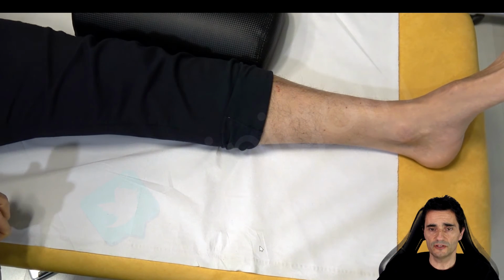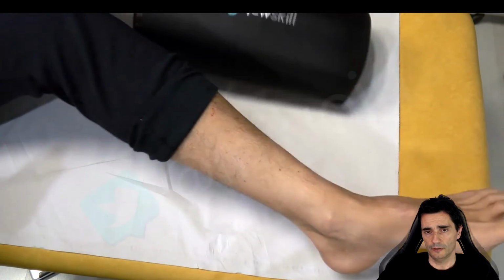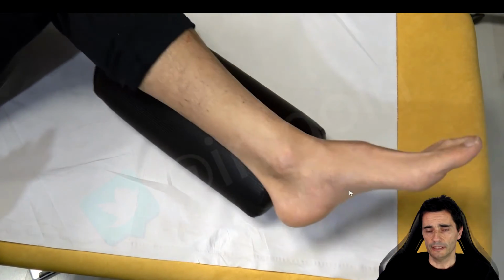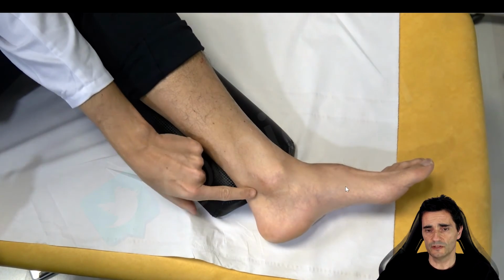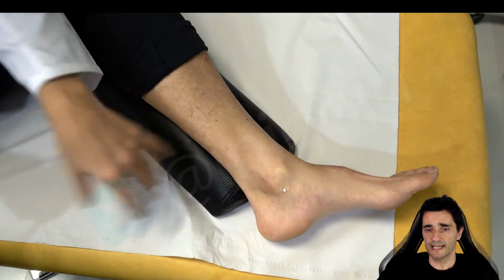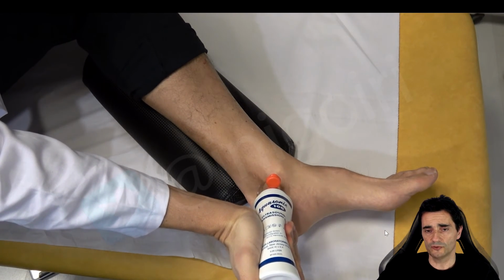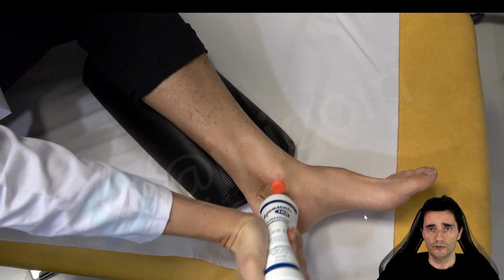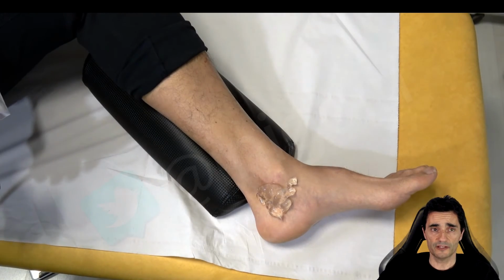And now we are going to check the ultrasound scan. To begin with, we will ask the patient to adopt a proper position. Usually I use a pillow below the leg, and the foot is free, and in this position, with external rotation of the hip, we achieve a good view of the medial side and a slight valgus of the ankle, and it's a good position to explore these structures. We use a generous amount of gel because we need to avoid bony contours and to help us with some structures.